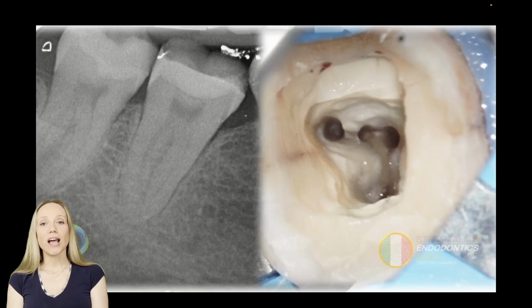And then we will have to examine carefully and maybe with a thin probe try to find the root canal openings when we open the pulp chamber.